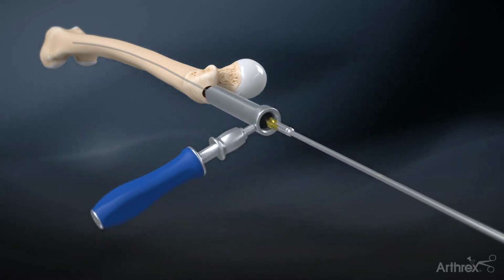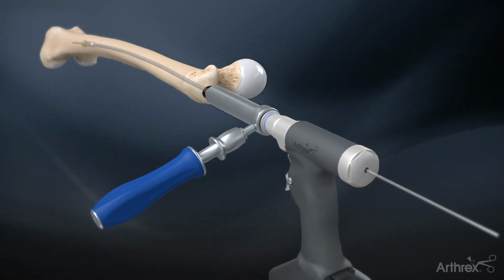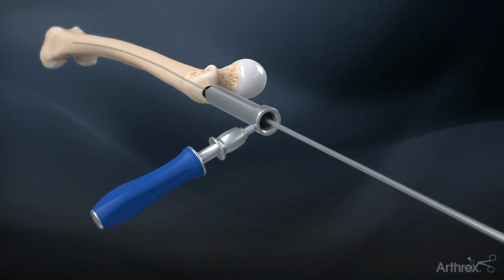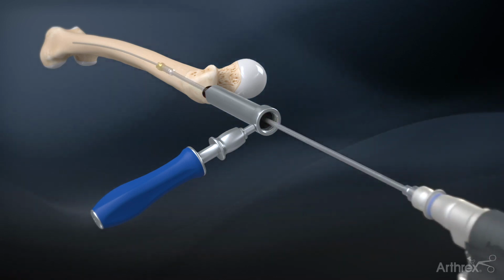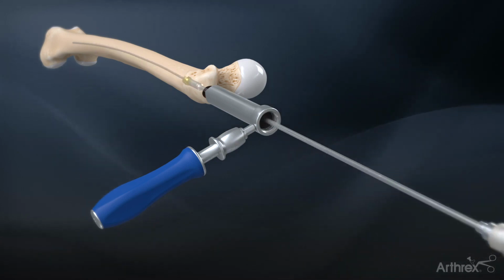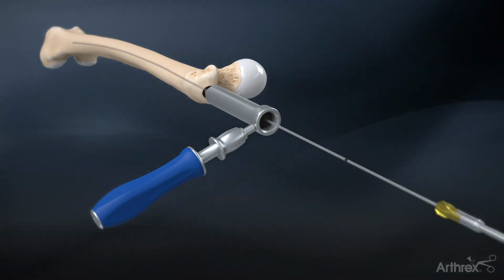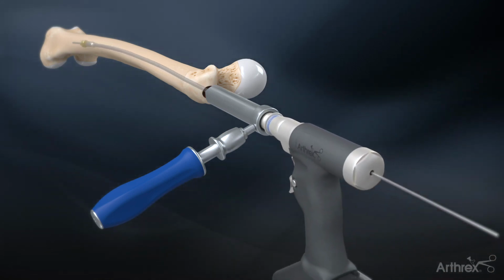The 8 mm end cutting reamer is used to ream out the central path for the nail. Progressively ream in diameter until cortical chatter is achieved. Ream 1 to 1.5 mm over desired nail diameter.